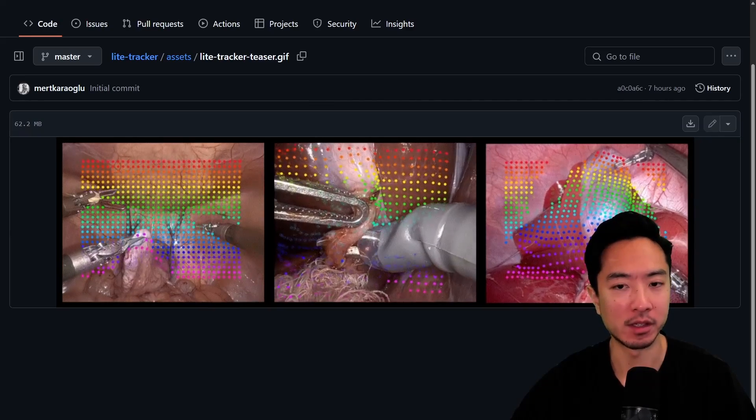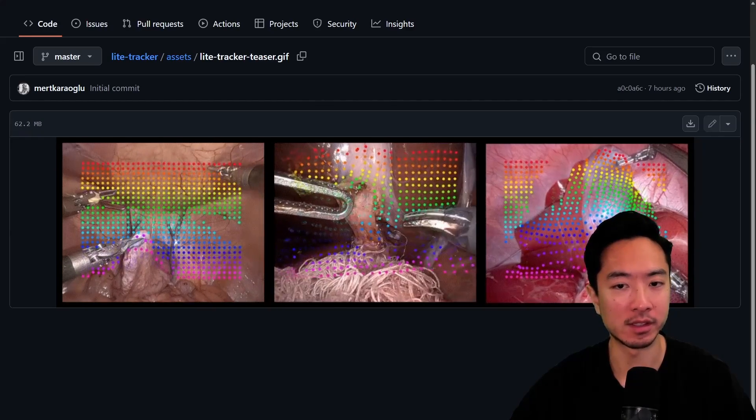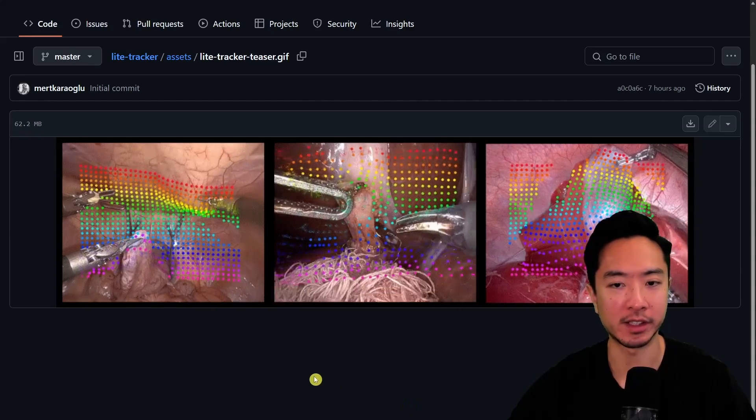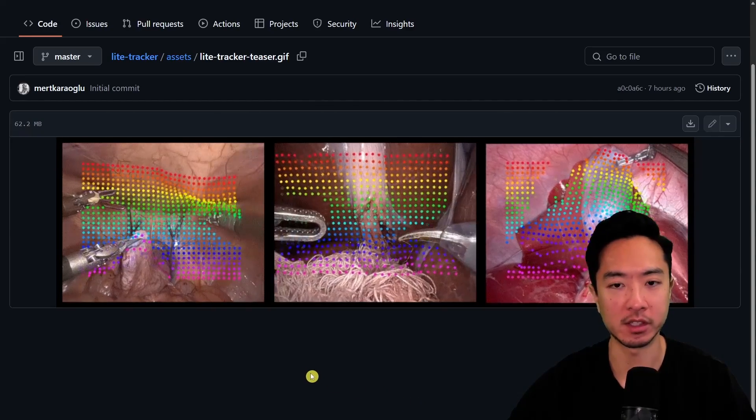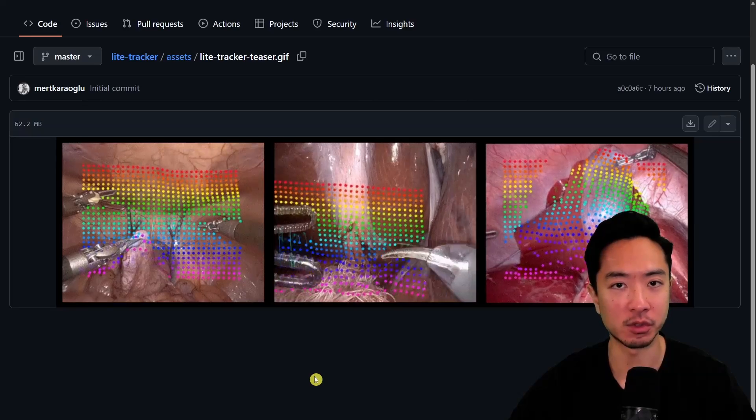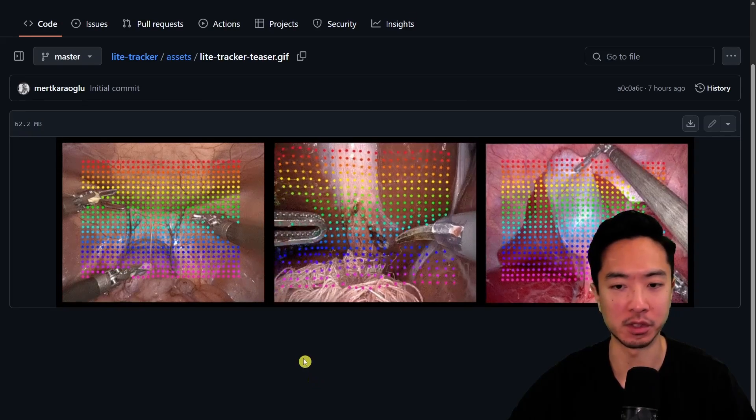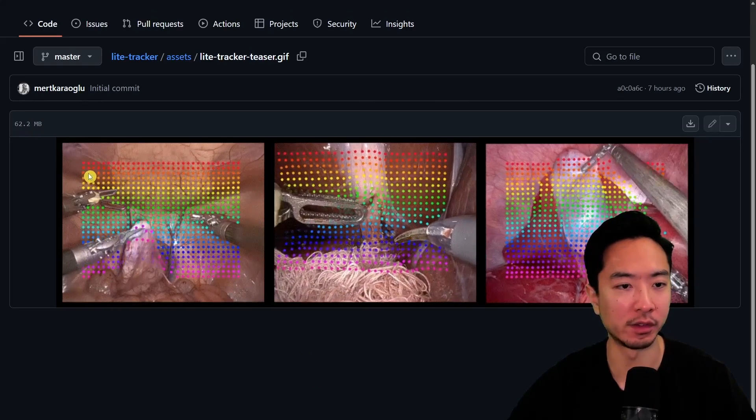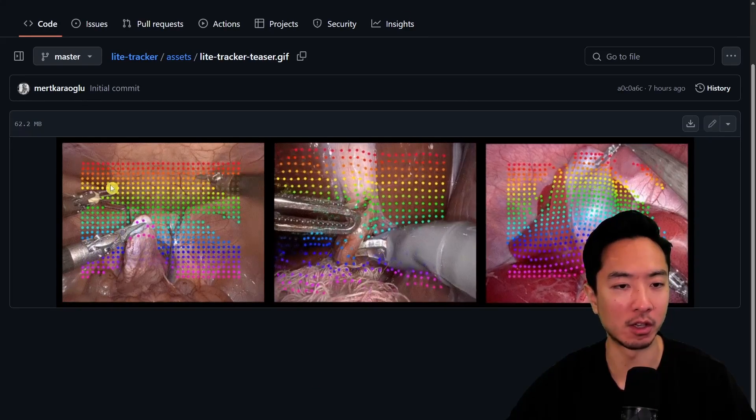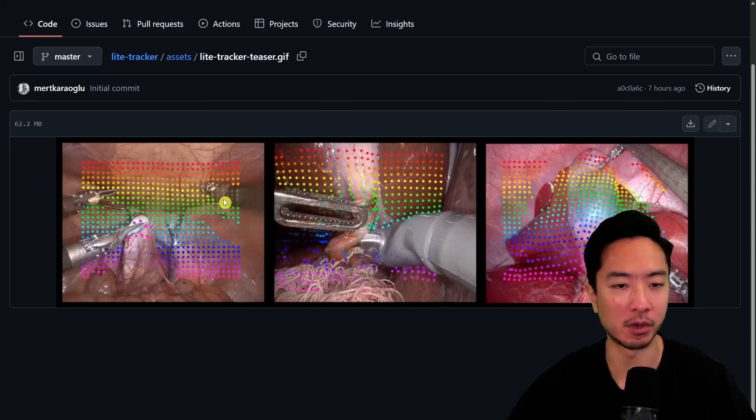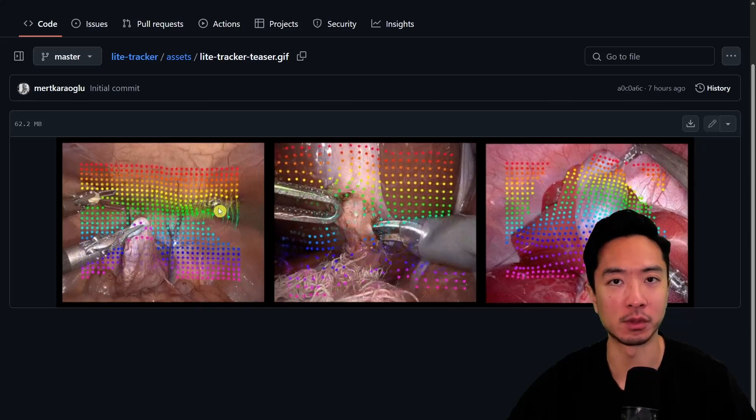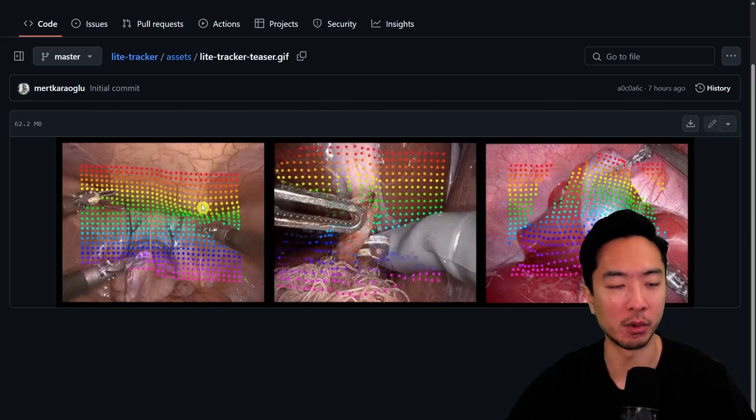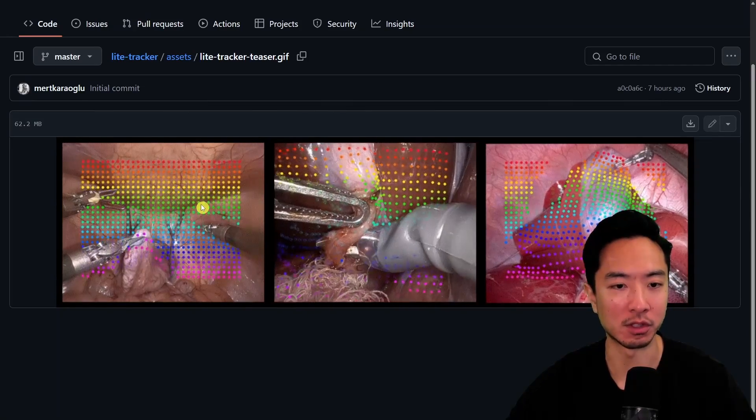LightTracker just came out, and what this is is a lightweight model that can track points on tissues, which is suitable for robotic surgery. You can see all of these different colored points are spaced apart, which gives you dense tracking of all the points on the tissue.